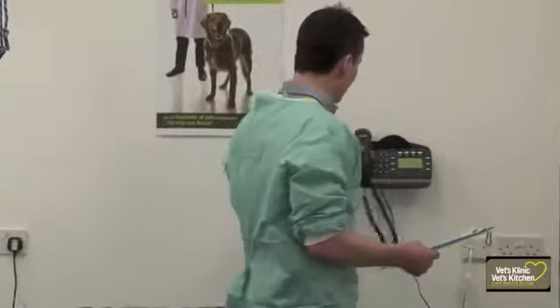Right, so the X-rays have confirmed what we expected, really, that he's got quite a nasty dislocation of the tail. It's sort of gone out of place and come back in. There's quite a lot of swelling and bony damage. So I think it's highly unlikely he's ever going to regain feeling and motion in his tail. So the best thing is to amputate his tail, and that's what we're about to do. He will go home minus his tail, but it will reduce the pain, and long term it's going to be a lot better for him.